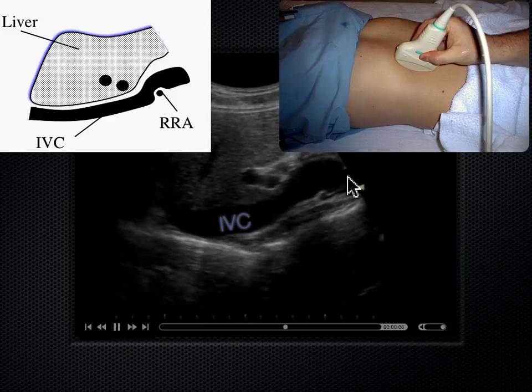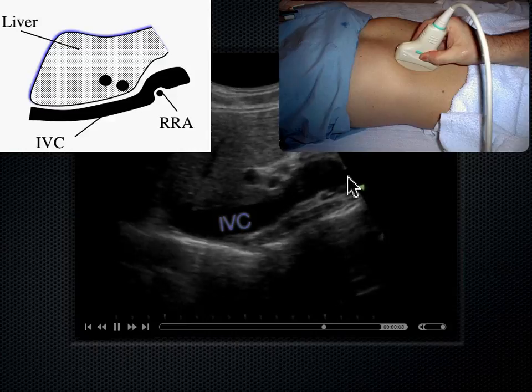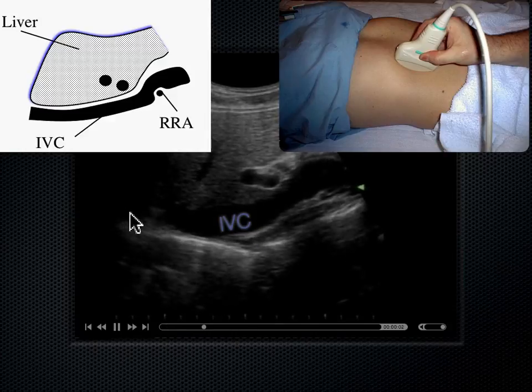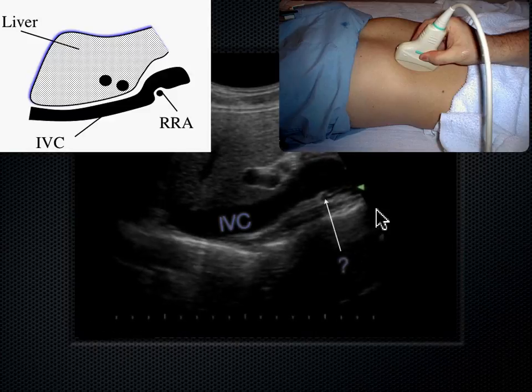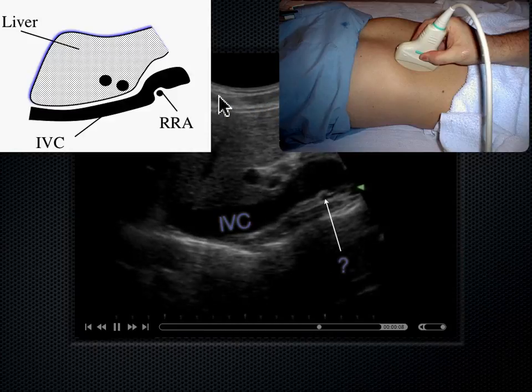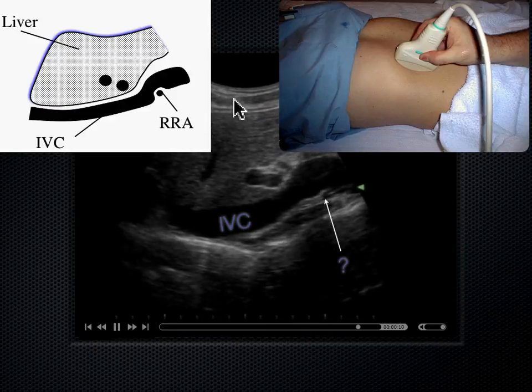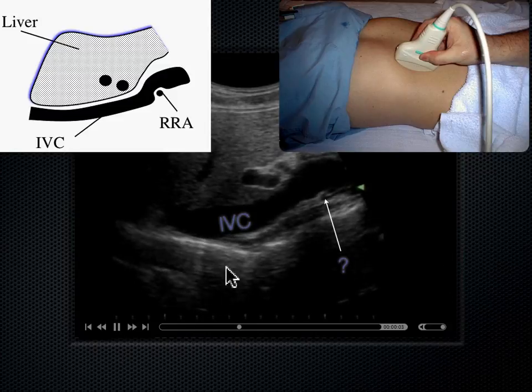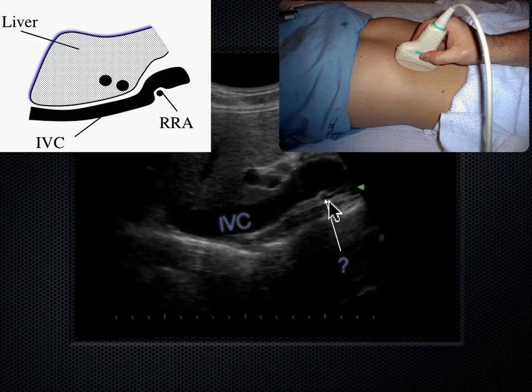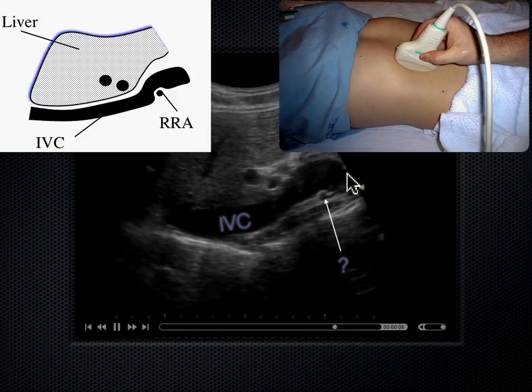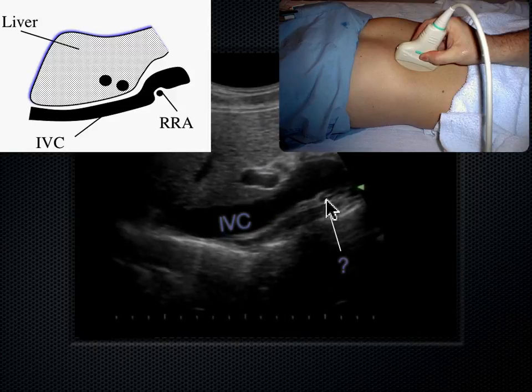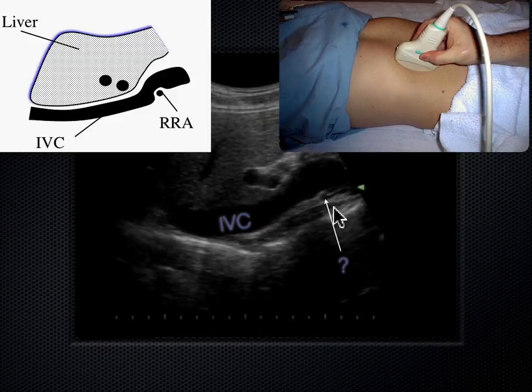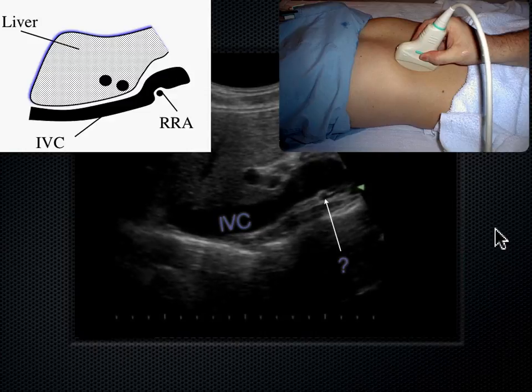The IVC runs up the right side of the spine, bringing blood back toward the heart — analogous to how the aorta runs down the left side. With the probe anterior on the skin and sound going posteriorly, the next question is: what vessel lies posterior, or behind the IVC, yet perpendicular to it? You can see the IVC in its long axis, while this other vessel appears round — in its short axis.